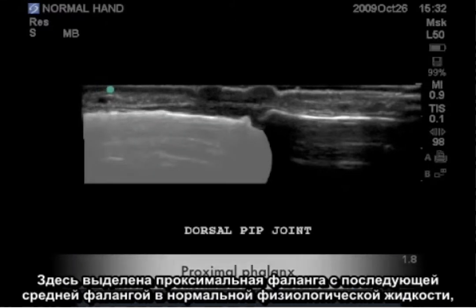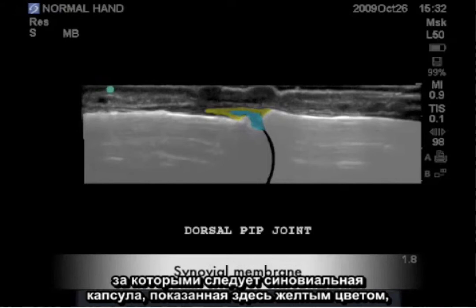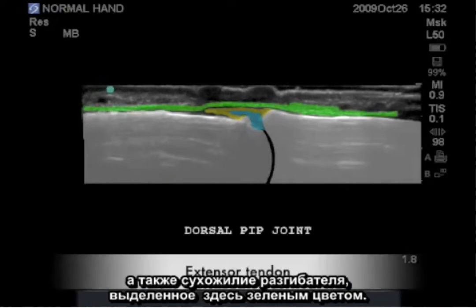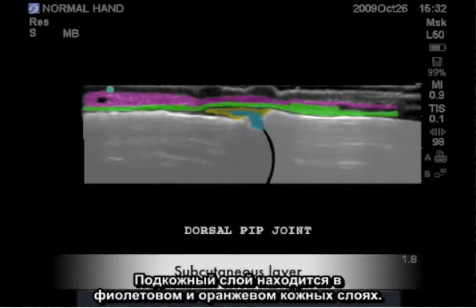Highlighted here is the proximal phalanx, followed by the middle phalanx in the normal physiologic fluid, followed by the synovial capsule highlighted here in yellow, and the extensor tendon highlighted here in green. The subcutaneous layer is shown in purple, and the orange cutaneous layer.